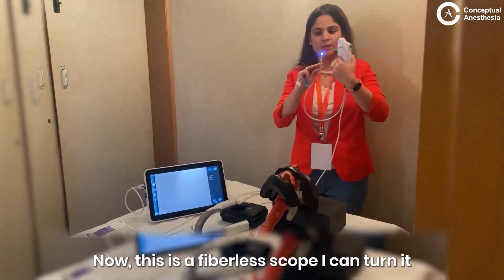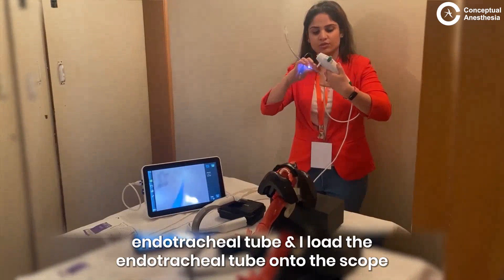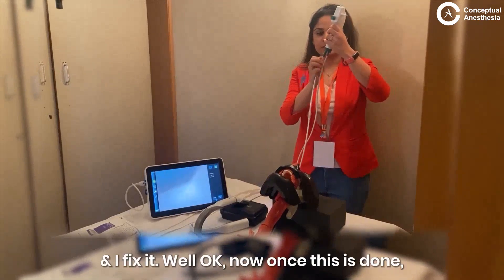This is a fiberless scope. I take a size 6.5 endotracheal tube and I load the endotracheal tube onto the scope and I fix it well.